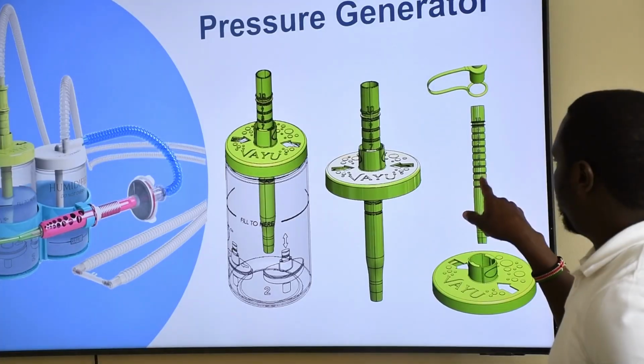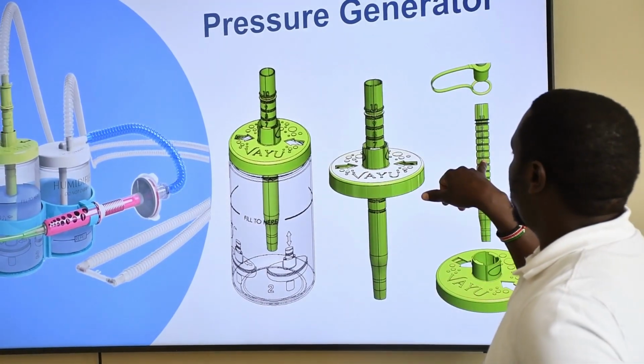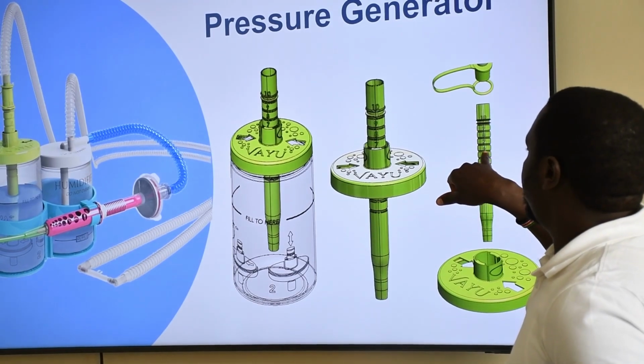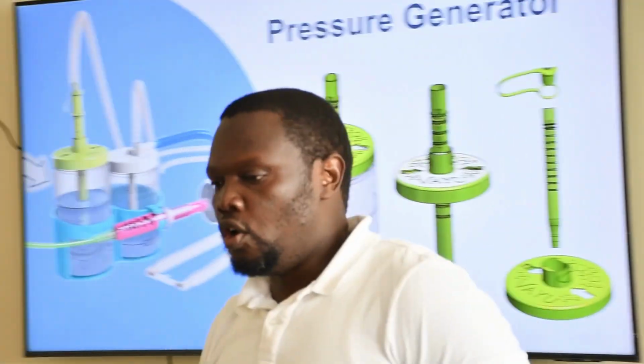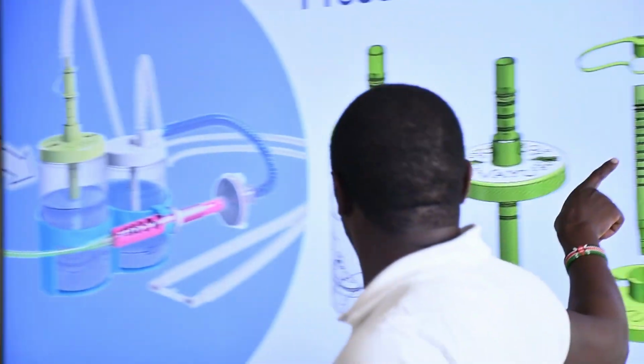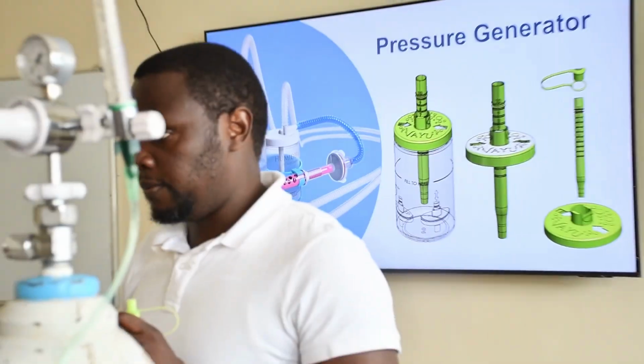Okay? So these numbers represent the pressures of water. So it's 4 centimeters pressures of water, 5, 6, 7, up to 10 centimeters pressures of water. The only way you can determine the correct pressures of water, the calibration, is this line. So we're sure that if you are within this line and your tubing is reading 4, then you'll be at 4 centimeters pressures of water.